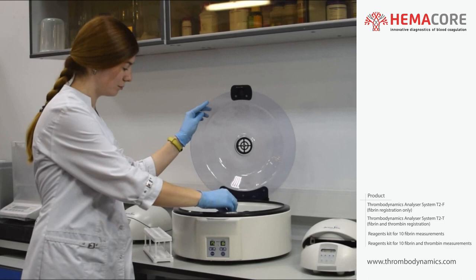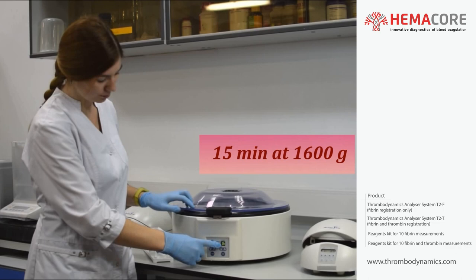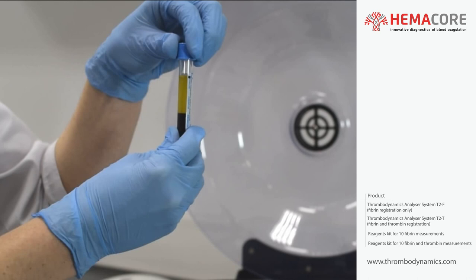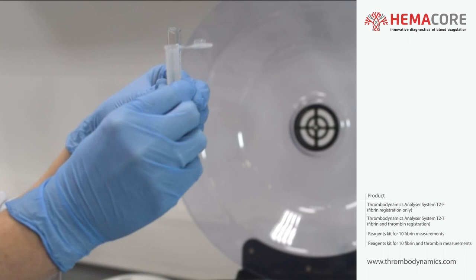Centrifuge the capped blood specimen tube at 1600 g for 15 minutes. When loading the centrifuge, take care that the tubes are evenly balanced. After the first spin step, the whole blood separates into three layers: a cell layer at the bottom, an intermediate layer known as the buffy coat, and an upper layer which is the plasma.